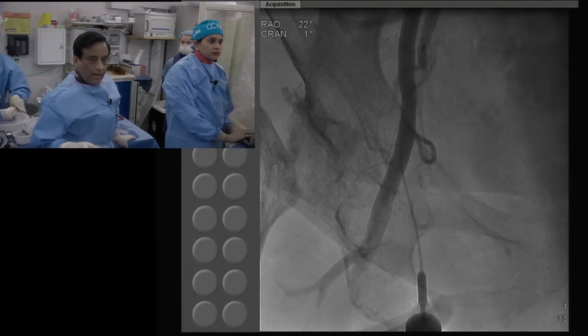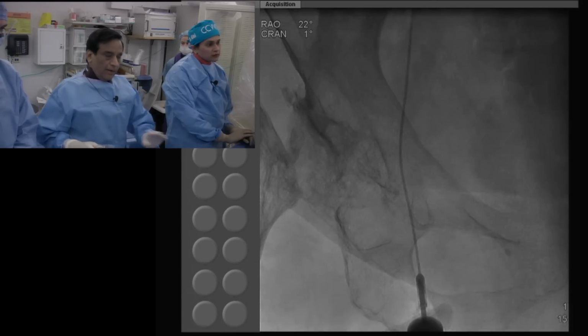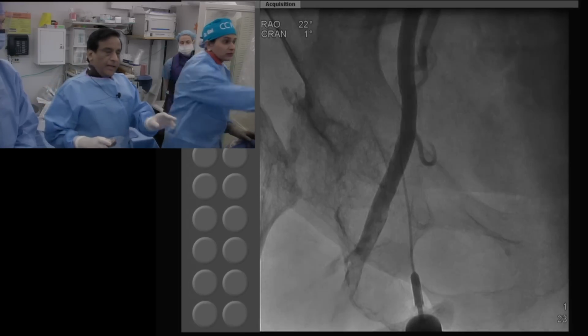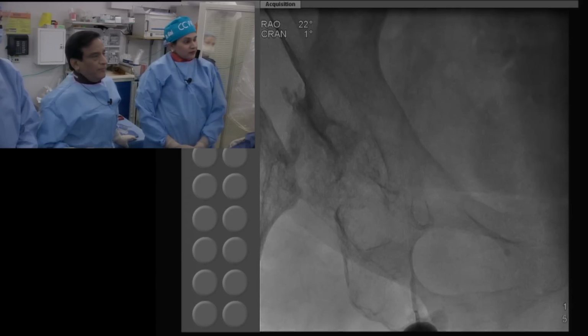So Impella is approved for this purpose at this time. A complex heart team discussion already took place and suggested the patient should have a PCI. So clearly you have the basic criteria of indication for Impella, despite the near normal LV function.